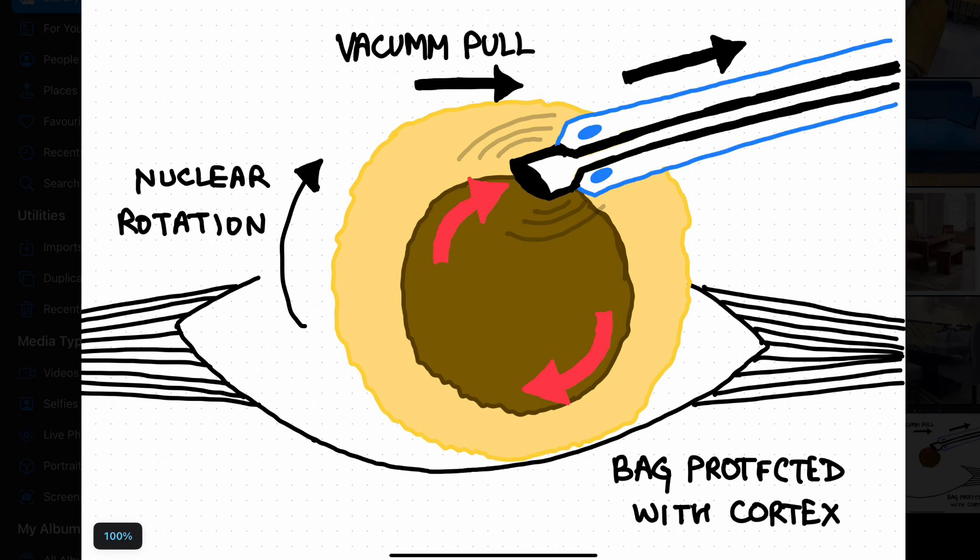In this technique, you first have to do gentle hydrodissection on the left side so that the right pole of the nucleus pops out of the bag. You have to make the nucleus stand vertical in the bag so that the inferior pole protects the bag and the superior pole is facing the main port. Once you introduce your phaco tip through the main port, bury your tip at the junction of endonucleus and cortex, and tell your OTA to switch the phaco to continuous mode, increasing the power to 30 or 40.